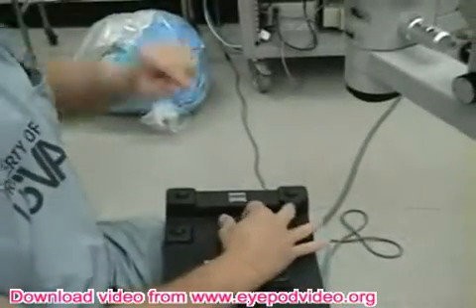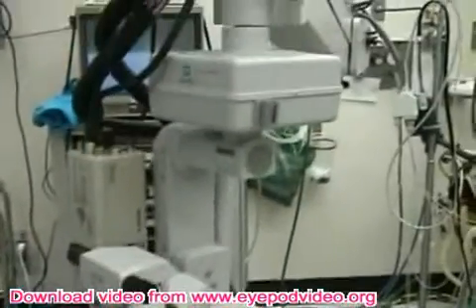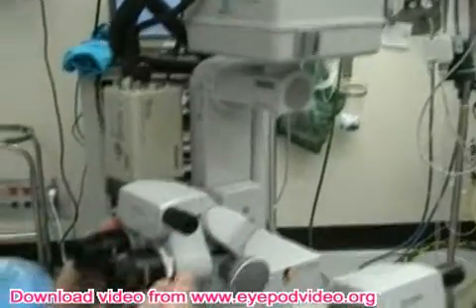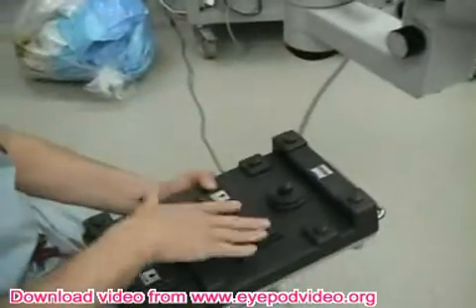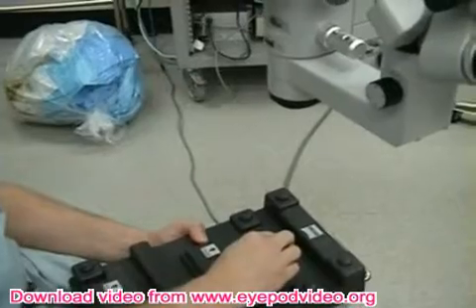You can see how it's moving to the left or to the right. These positions left and right are always relative to the surgeon microscope, so you have to keep that in mind. This is in the same direction as the surgeon, so when you go up the microscope goes up, and when you go down the microscope goes down.